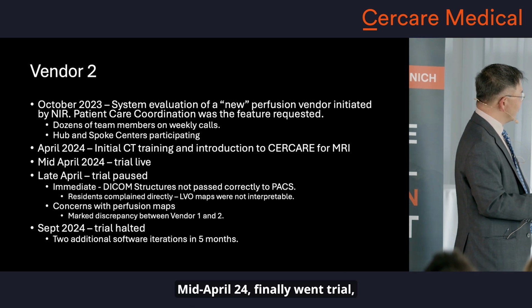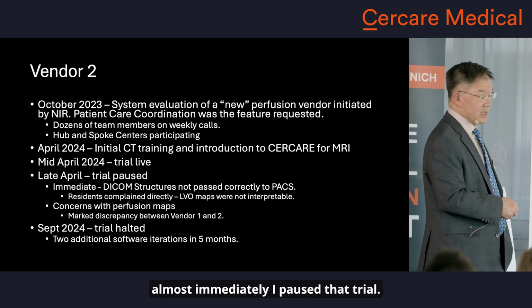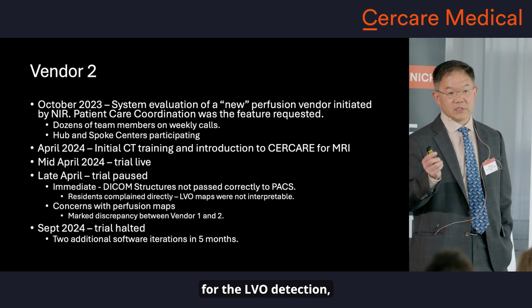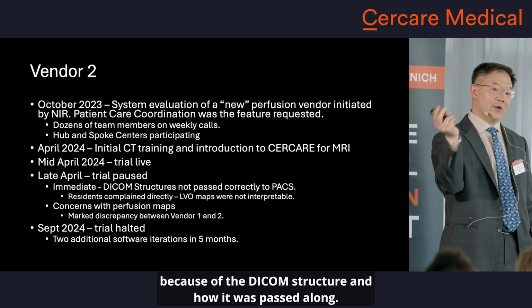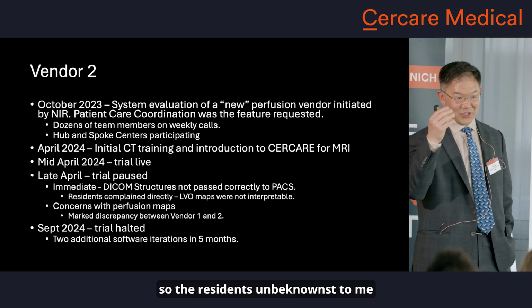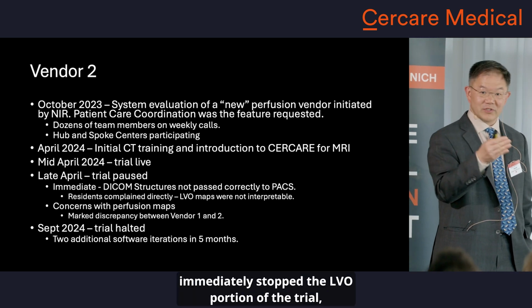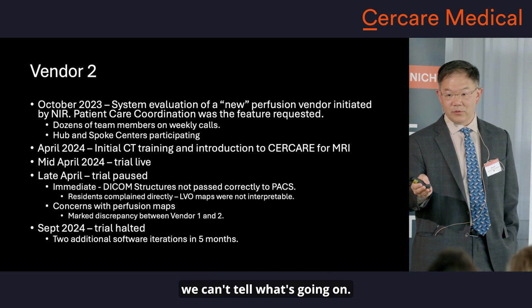Mid-April 24, finally the trial went live. Almost immediately, I paused that trial. First of all, the first images that came across for the LVO detection, the residents couldn't see the LVO because of the DICOM structure and how it was passed along. There was poor PACS integration, so the residents, unbeknownst to me, immediately stopped the LVO portion of the trial, telling our IIT people, stop it, we can't tell what's going on.